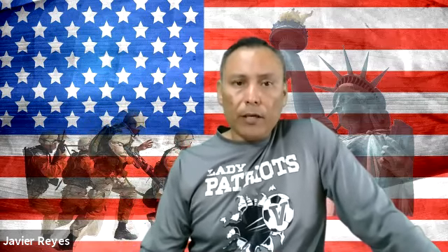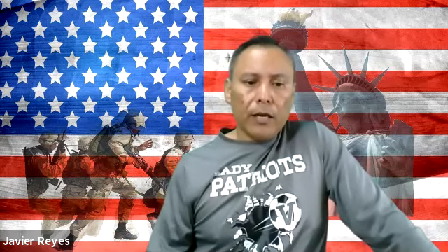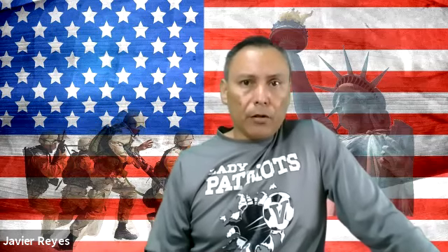So let's say you collected a light blue for coagulation studies, and the results are above the reference range. Well, it's going to be somebody's job to make sure that the physician knows the results. Let's say you're the phlebotomist in charge of reporting results. If you call the physician, you have to make sure that you get the name of the person you gave results to.